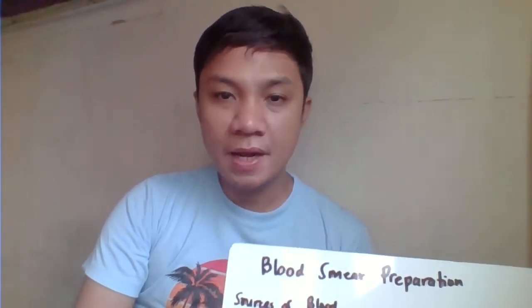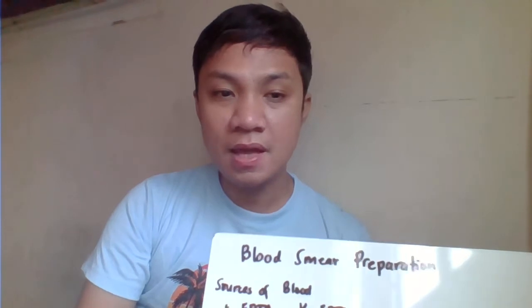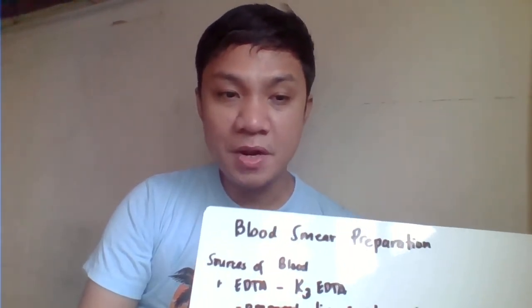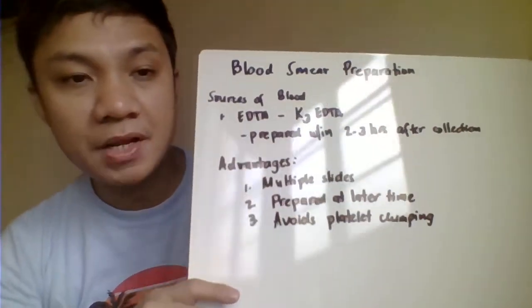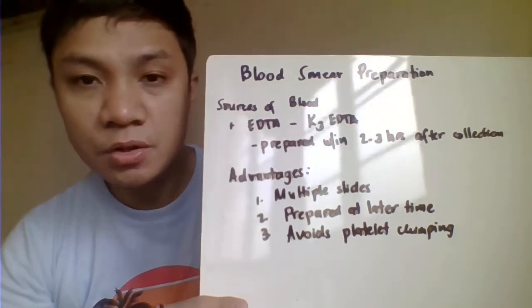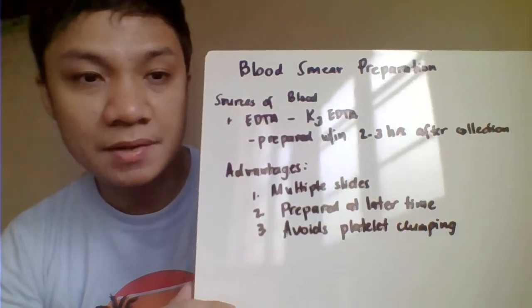Okay, so today we're going to discuss all about blood smear preparation, and later on we're going to discuss hematopoiesis as well. So we start here with the blood smear preparation. For your blood smear preparation, we have different sources of blood that we can use for doing our blood film or blood smear preparation.